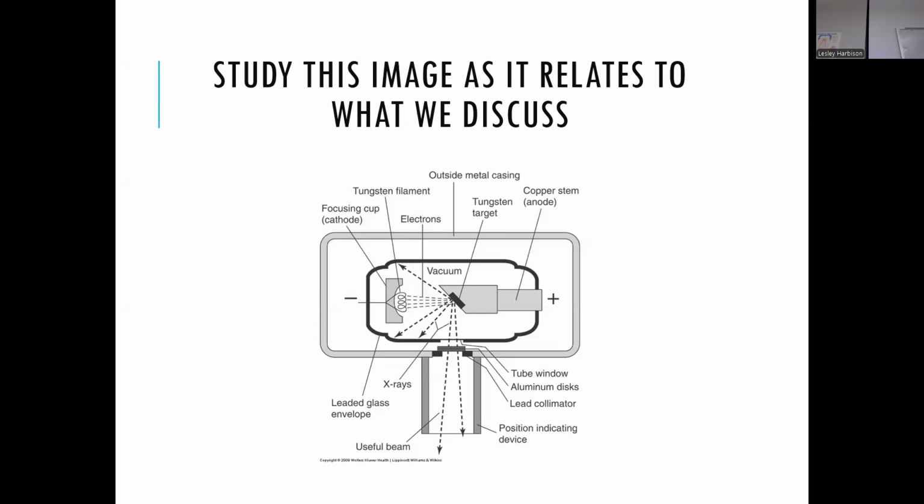The whole thing is leaded glass, and then there'll be just this one little window of that leaded glass that's unleaded so that the x-rays can come through. Okay. So it'll look the same, just its makeup is unleaded glass as opposed to leaded glass. Yeah. And that's the break that's at the bottom? Yes. So that's that break at the bottom where the red is streaming out. That's indicating where the unleaded glass is.